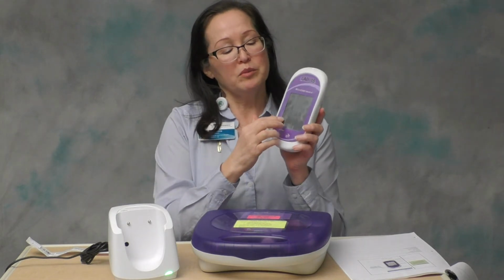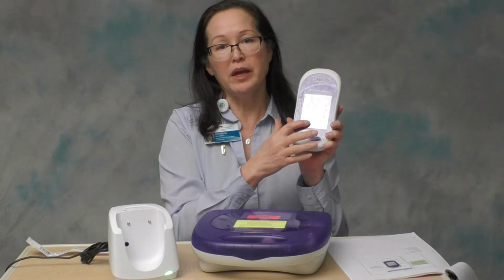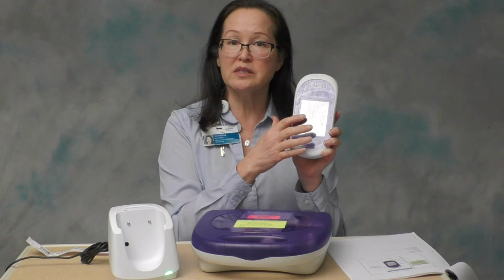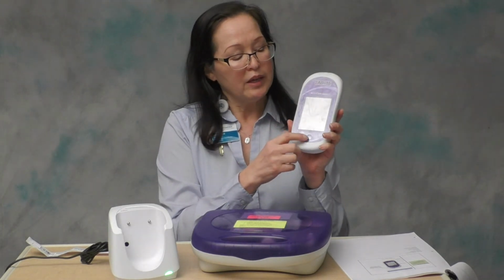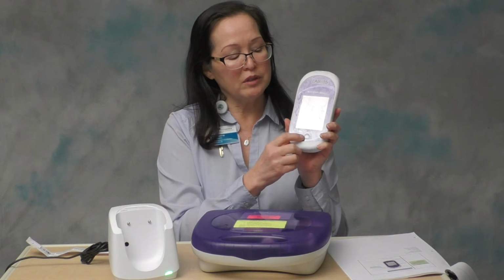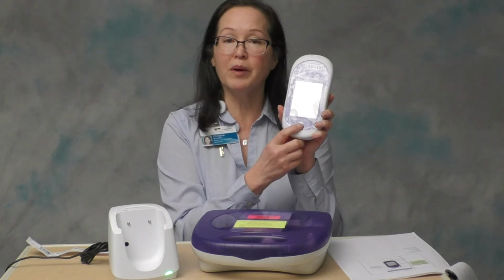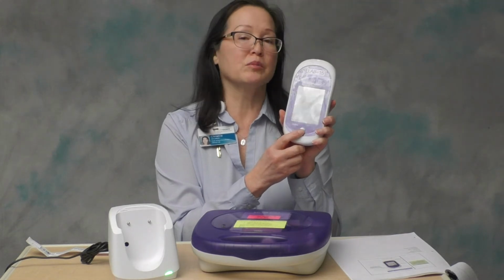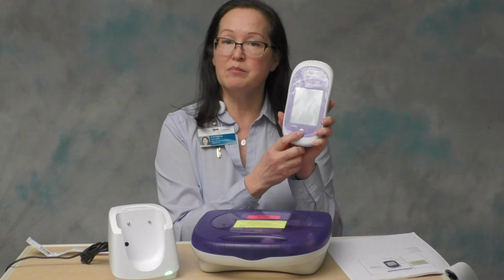On the front of the instrument, you will see a touchscreen display pad. When you turn it on, it will display the main menu where you can access QC testing, patient testing, or a review of the results. Just below that touchscreen display pad is a little button that's sort of raised. This is your on-off button. It's used to turn the instrument on and turn the meter off. It is also used to reset the meter.